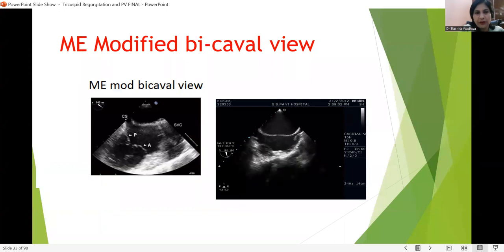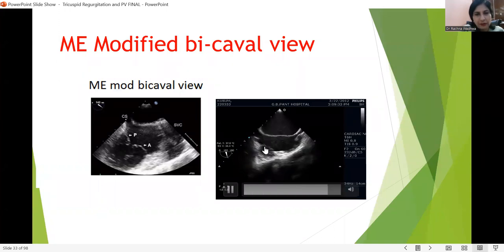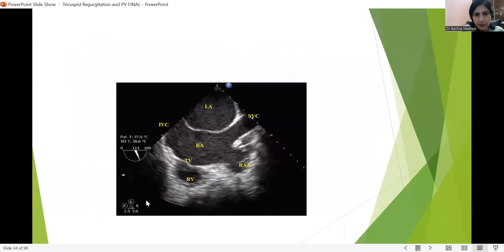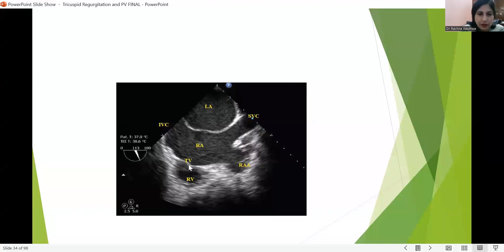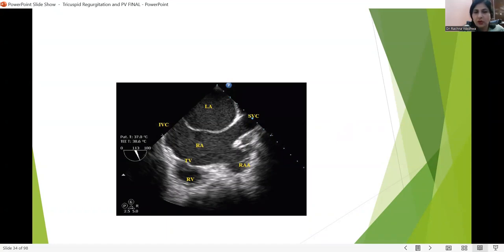The mid-esophageal modified bicaval view: in a standard bicaval view, we see the SVC, IVC, interatrial septum, LA, and RA. But in the modified bicaval view, we see the tricuspid valve — the anterior cusp and the posterior cusp. This view is very important because the Doppler line is actually aligned to the tricuspid valve inflow. So all continuous wave interrogations are based on this view. Measurement of IVC diameter and tricuspid valve regurgitation can be estimated here. This view is obtained by increasing the angle to 110–120 degrees at the aortic valve short axis view and moving the probe slightly to the right.